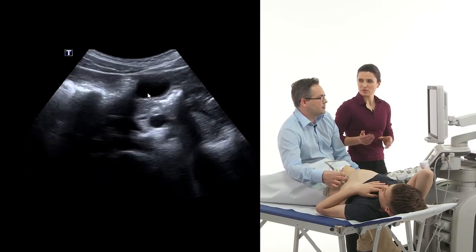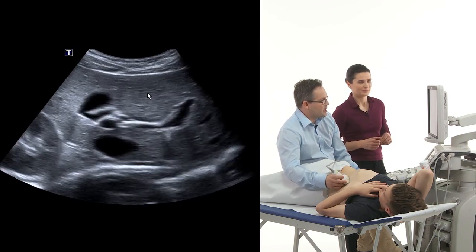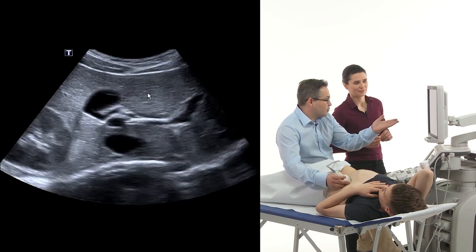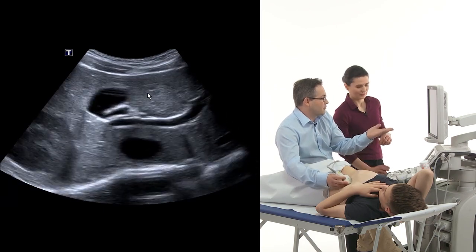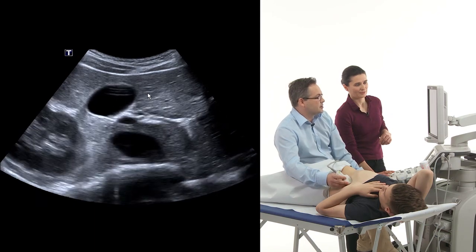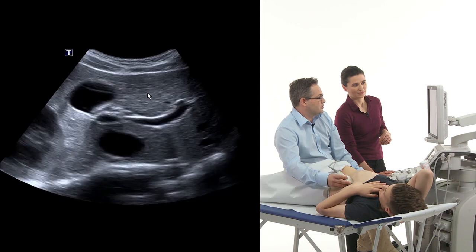So with this approach, you start with a transverse view of the gallbladder, don't you? Of course. And I prefer this view because the center of the liver, the porta hepatis, is a quite familiar view for us. When we check the liver, we always take this plane. So it's easy to find the gallbladder when you have found this view.